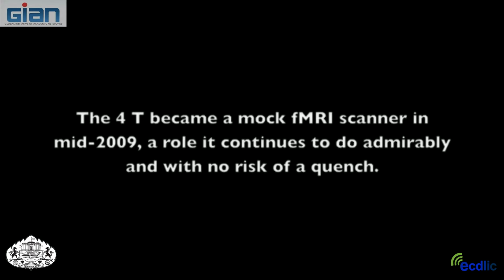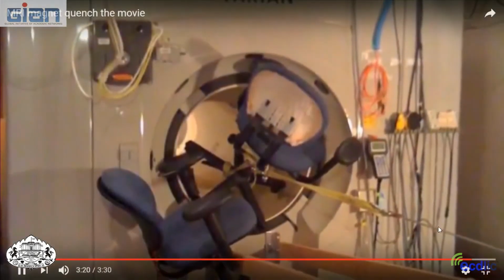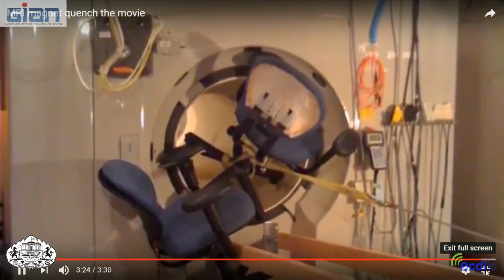Okay, so that was a 4T magnet that they ramped down. You can see there's a lot of things that were happening there. The biggest, of course, being this liquid helium boiling off. And you can see that they said it was so cold that it was liquefying the air as it went out. And that's a lot of money of helium there, liquid helium that's boiling off.